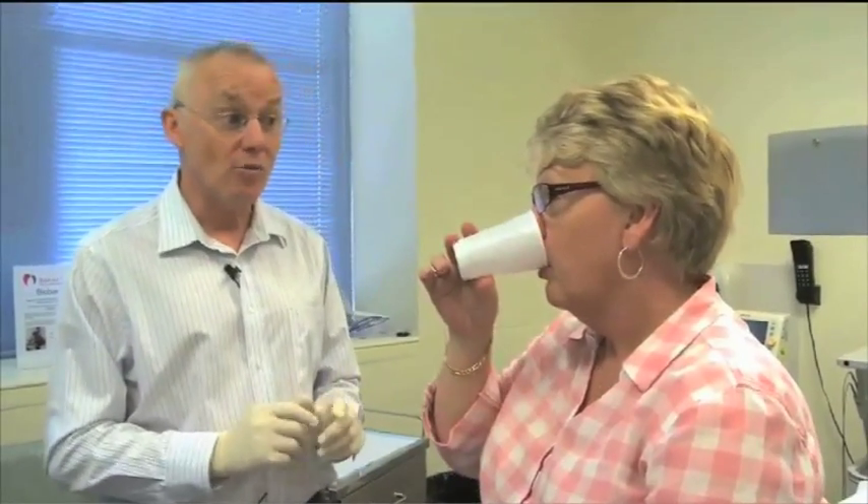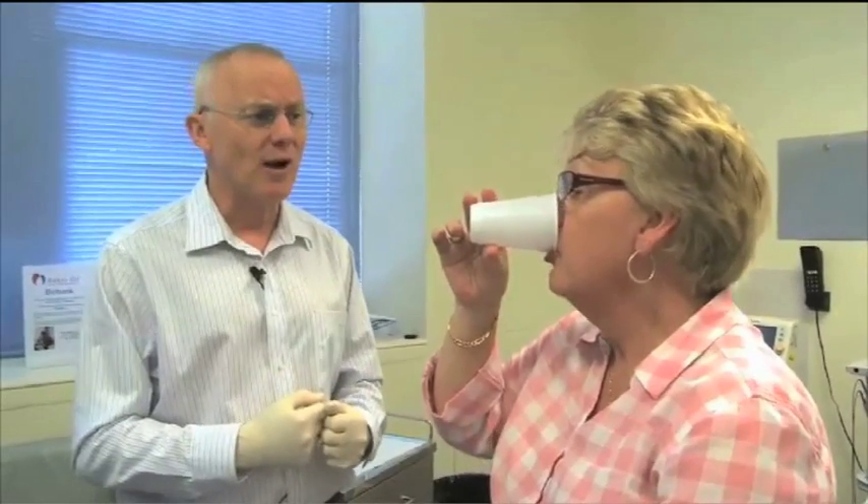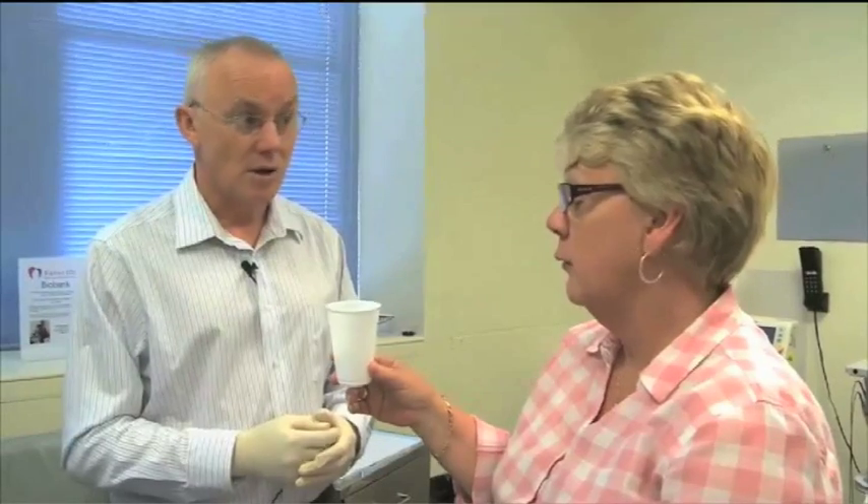Okay, Lynn. Now I want you to drink that quite quickly — not the way we normally want you to drink, but gulp it all down quite quickly and let me know if there's any problem at all. No, that's fine. It's gone down fine — going through? Thank you. Feels good. I like to make sure that it's not sitting. So it's important that we check that someone can drink — I like about 30 mls of fluid, maybe a little bit more, two or three gulps, just to be sure that it's going down comfortably. The chances of someone coming back if it's going down well is very low.